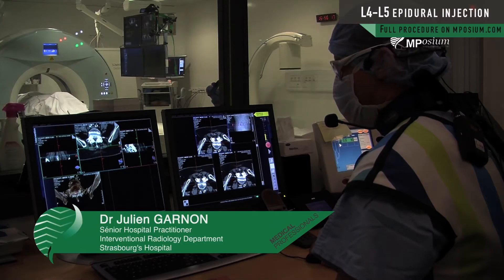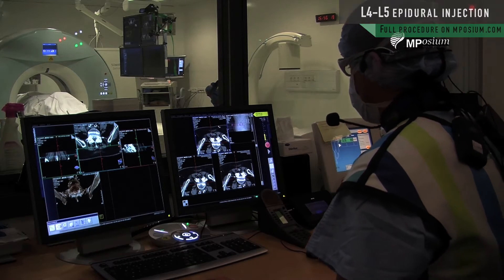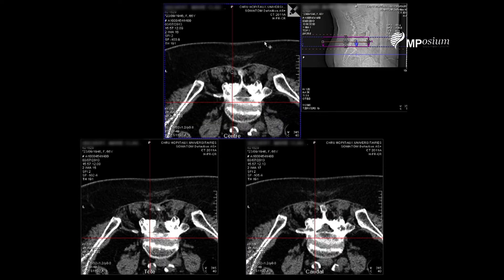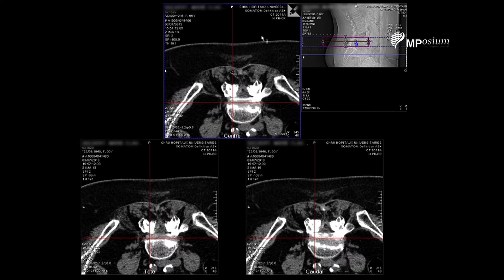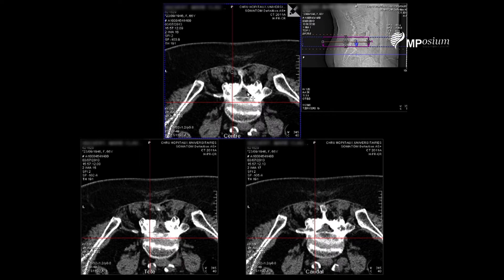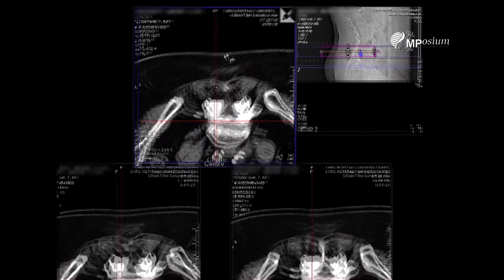The physician asked us to do a L4-L5 right epidural injection. Right now I'm doing the planning of the infiltration. The goal is to finish here in the epidural space, and for this we're going to puncture the skin here.